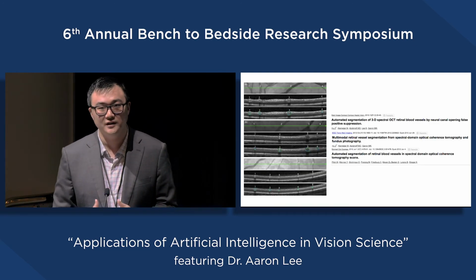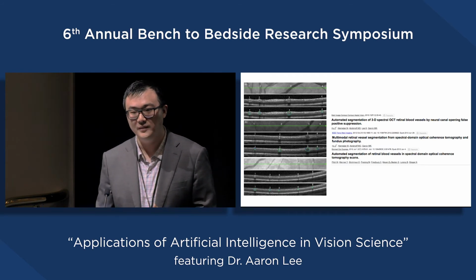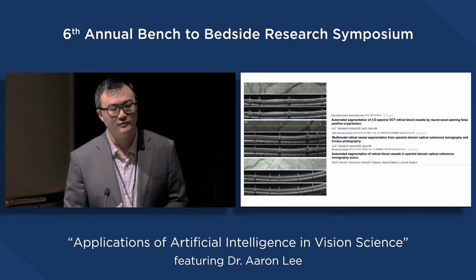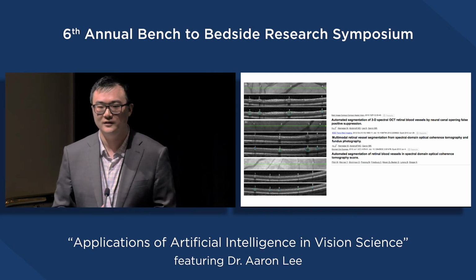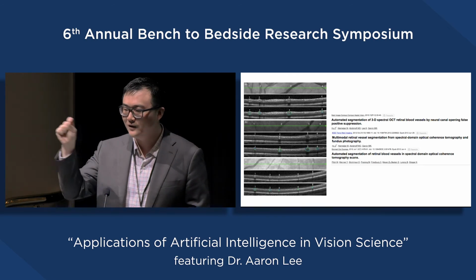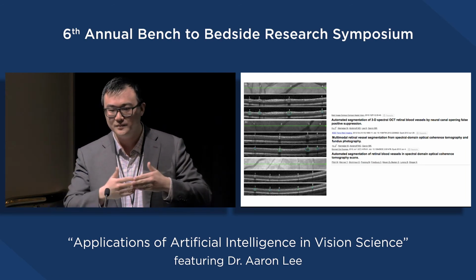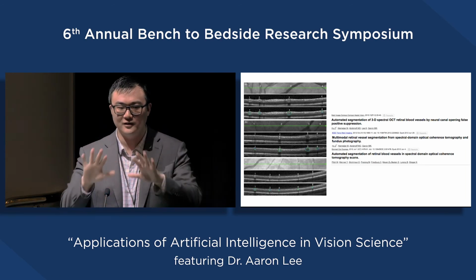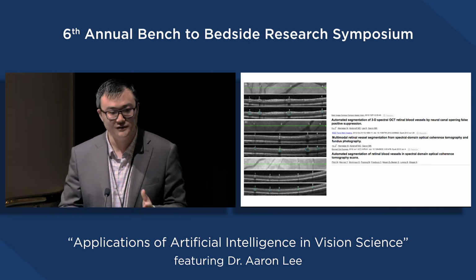Another image-to-image area that we're really excited about actually came accidentally. So I remember these papers before OCTA existed. They were going to hand draw all the vessels on the OCT B scan, and if you do that for a really dense OCT scan, you could take that en face and make it look like an OCTA before OCTA existed. So I wanted to do that.